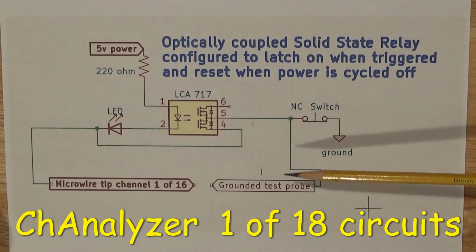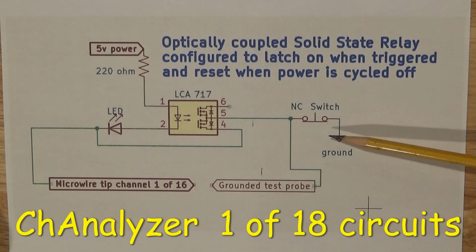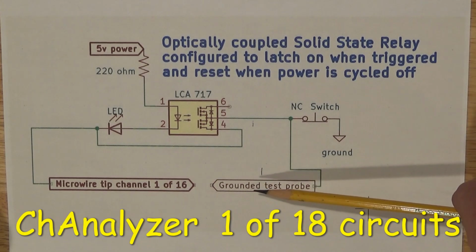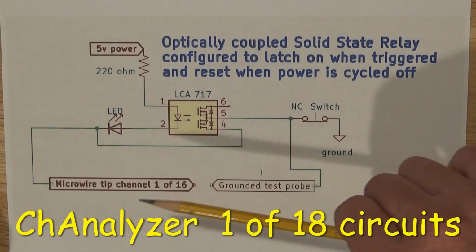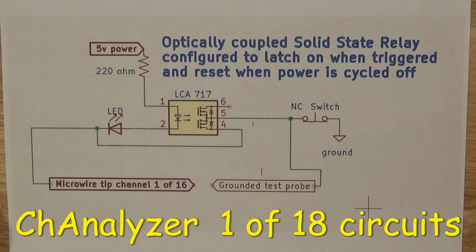And the way it works, there's a grounded test probe here that's fed ground through a normally closed switch. This switch is located on the grounded test probe, and on the tip of the probe is a very fine needle. And the way it's designed to work is under a microscope with the electrode facing up, where you can see the tips of all the micro wires in the array.